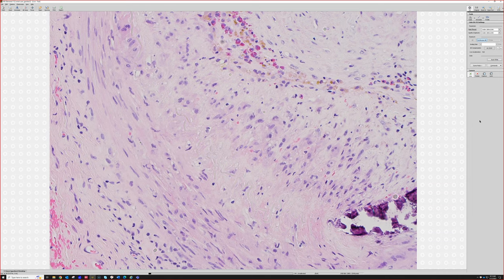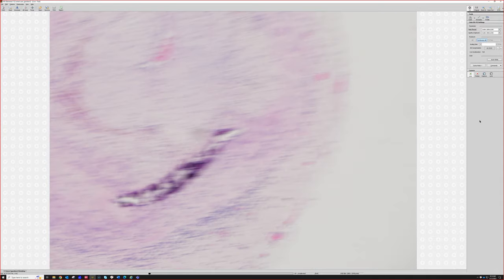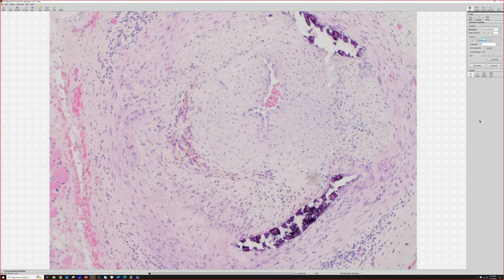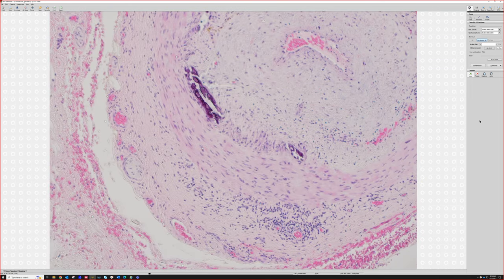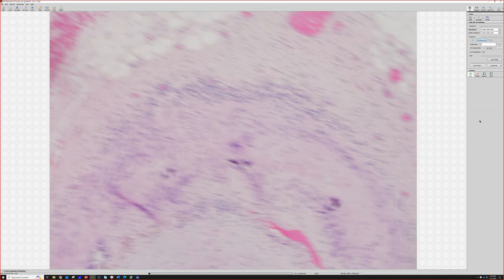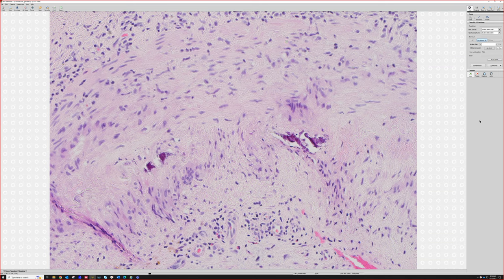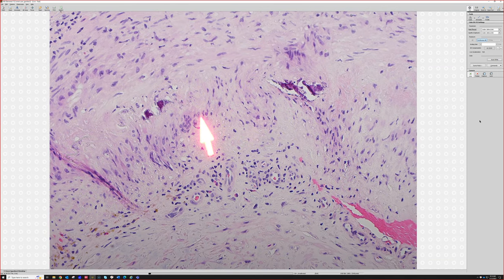So sometimes after you treat it with steroids, all that's left is a zone with the loss of the elastic lamina and some kind of scarring of the vessel wall. But here we've got a nice active example of giant cell arteritis. I would say that the majority of these biopsies I look at show either nothing or very minimal reactive change and not inflammation. So I find them quite frustrating to look at, to be quite honest. But every once in a while, we get an example like this that is totally diagnostic and no hedging is needed. We got giant cells in the wall of the vessel.